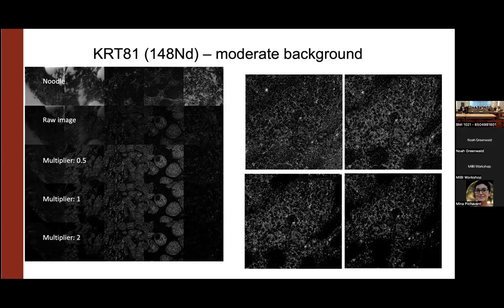So you can say, oh, I want to decrease this by 30% or 40%. It doesn't matter if it's a 2 or 3 or 5. It actually does decrease by exactly the proportion you want it to. And so the benefits of this is that the images look a little bit more cleaned up. It helps automatically denoise some of the very thin signal, and it makes the coefficient subtraction more accurate.